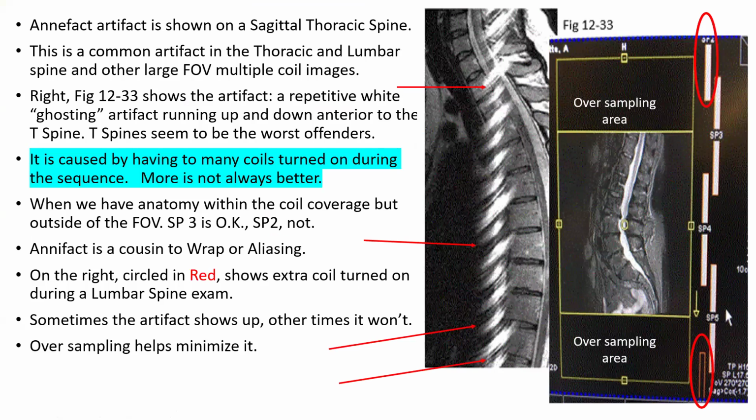Next one here, this is called anafact, and here's the artifact right here. It comes from having too many coils turned on for your field of view. So here's your field of view, and you've got extra coils turned on that you shouldn't. So less is more.